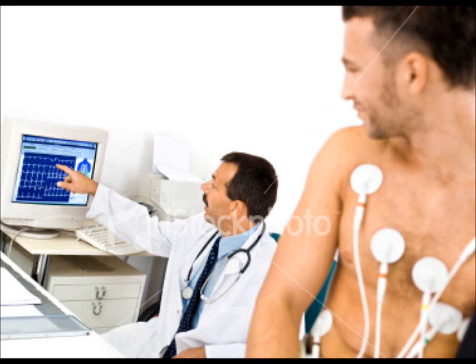The ECG also provides information on the orientation of the heart in the chest, the conduction disturbances, the electrical effects of medications and electrolytes, any mass of cardiac muscle, as well as the presence of ischemia-related damage.